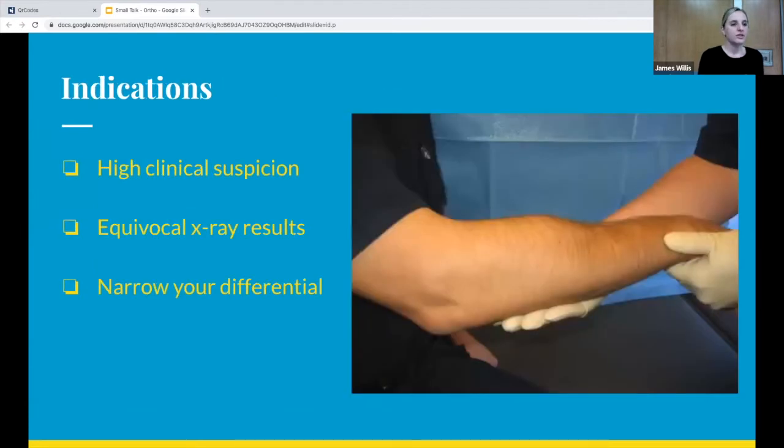So usually when patients present after traumatic injury, and especially in patients like this with an obvious deformity, the first thing that we're going to get is an X-ray, and that's the gold standard for diagnosing fractures. X-rays are generally safe. They're quick to get. They have low exposure to radiation, and they can give a lot of information really quickly. If you have any concern on an X-ray, or a concern about a patient and the X-ray doesn't really support your suspicion, CT can also be used. That has higher levels of radiation. It's time consuming, and not as easy to get a lot of the time.